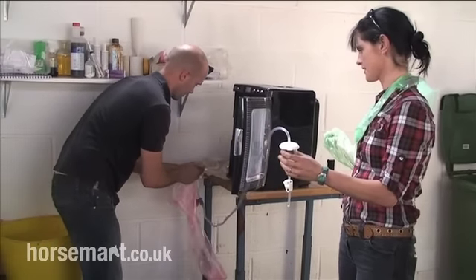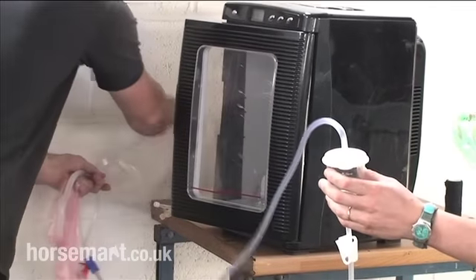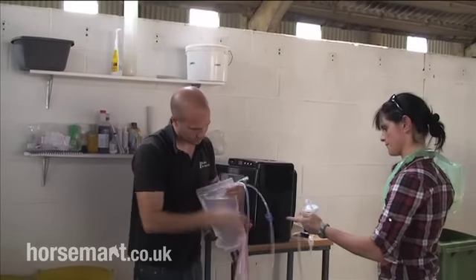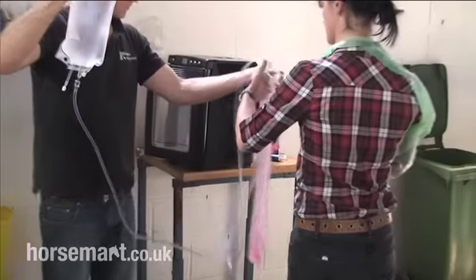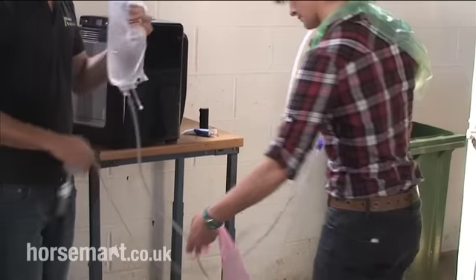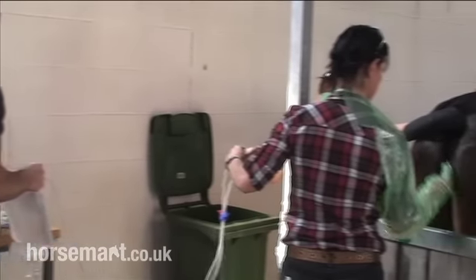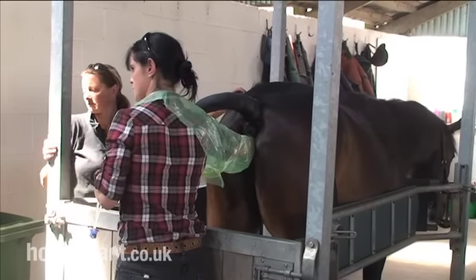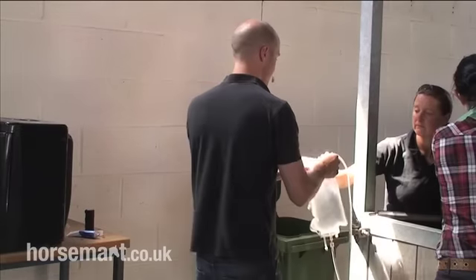Looking here at the incubator, Jamie is in the process of fixing the tubing to a bag of embryo flush media — this is what's going to be run into the mare. The tubing allows the fluid to run down into a Foley catheter, which is inside that pink bag at the moment. The Foley catheter is sterile. It's going to be introduced into the mare through her vagina and through her cervix, and then the cuff will be inflated to prevent backflow of fluid. It'll be pulled back against the cervix, and then the fluid will be run in. Once a significant portion of the fluid has been run in, the blue and red stopcocks will be turned off, and the fluid is then drained back out through a filter, which hopefully will capture an embryo.